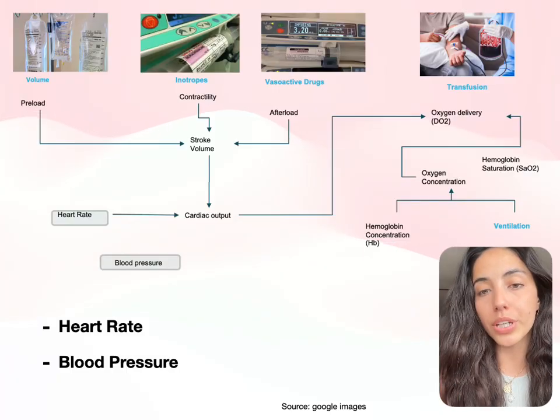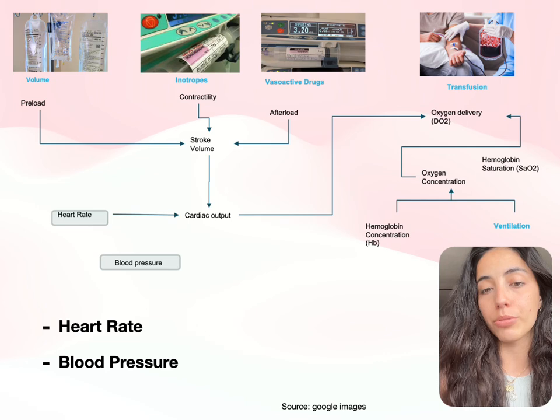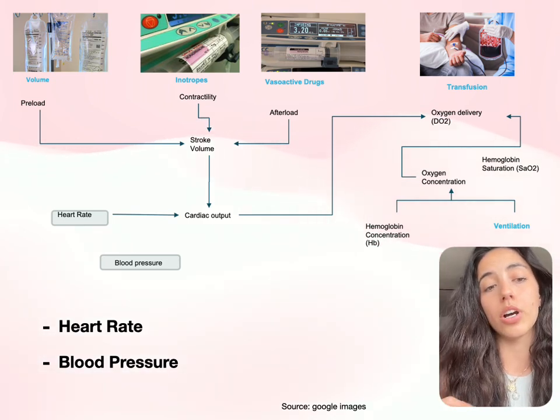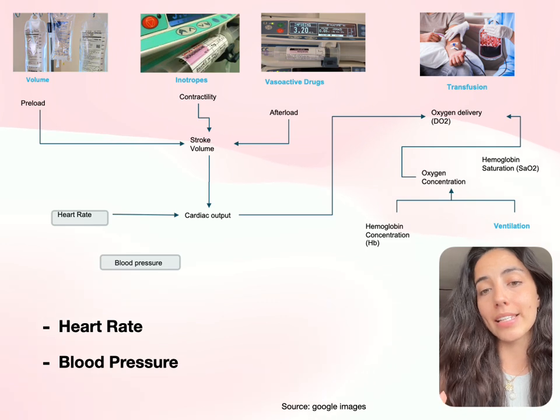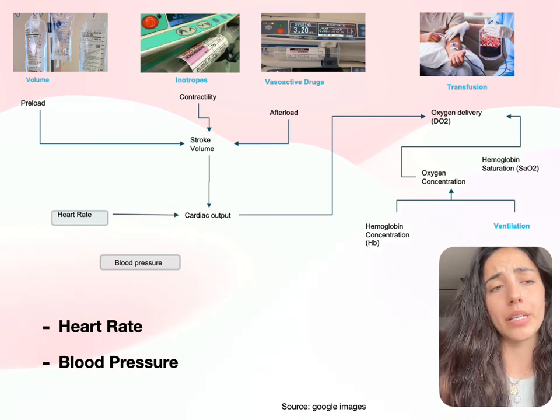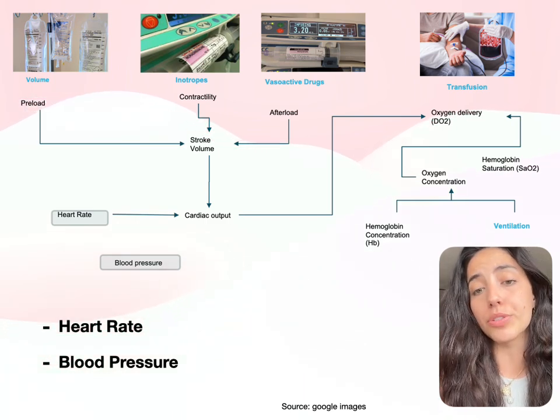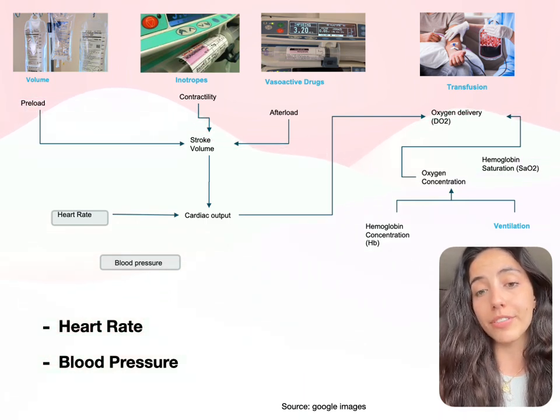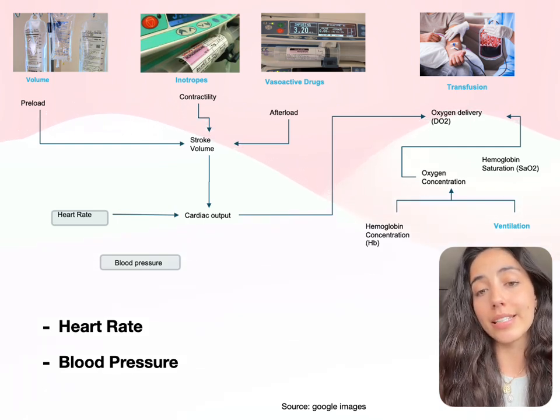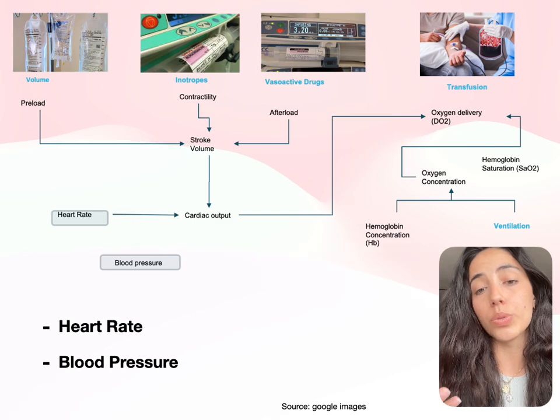So as we can see over here, we have a diagram of the standard monitoring techniques in common practice, which would be heart rate and blood pressure, and the insight that we can receive through using more advanced non-invasive monitoring. We can get input into a patient's preload status, essentially how much volume they have, which is very valuable when you are displacing such a high volume when using dialysis.